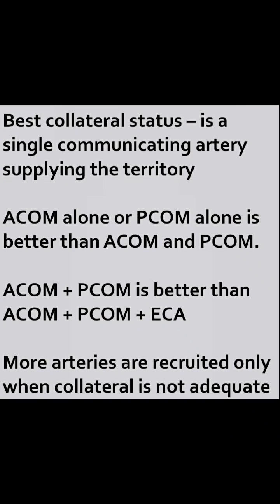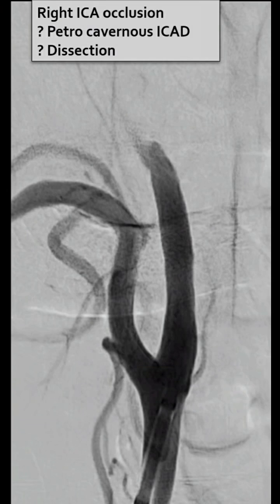It is important to note that if more collaterals are recruited, i.e. ACOM, PCOM and the ECA ophthalmic collateral, then it is a poor perfusion status. Leptomeningeal collateral certainly means that the perfusion is grossly impaired and this patient would need intervention.